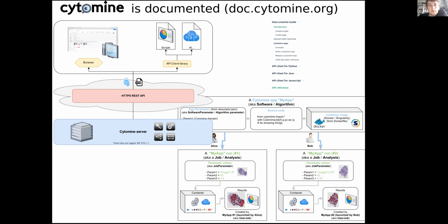Cytomine is documented. We made a major effort this year to have a better documentation website, and especially for data scientists. So if you go to doc.cytomine.org, you will have access to this data scientist guide where we explain the main principles, and we provide a step-by-step example to integrate your own algorithm into Cytomine.